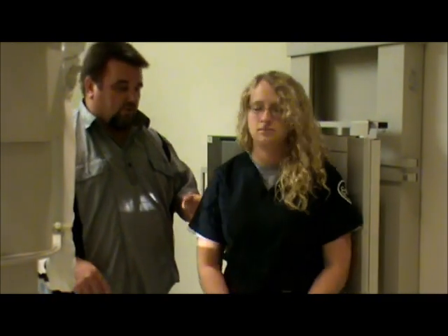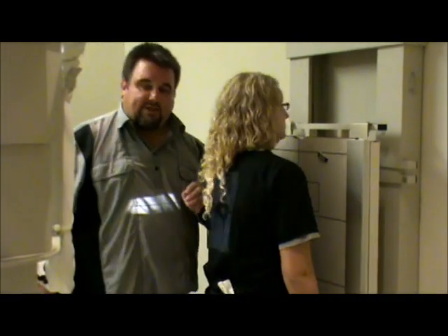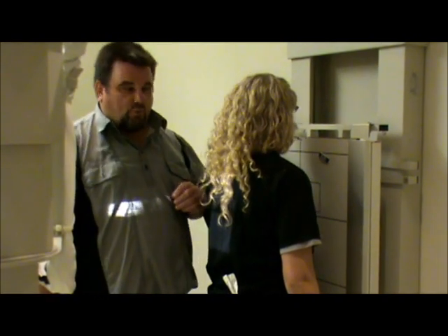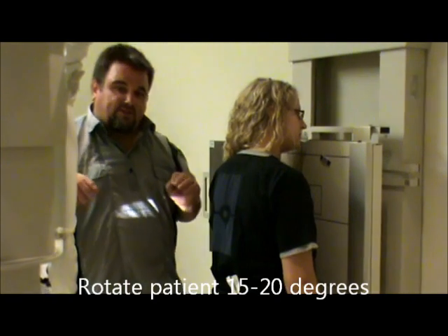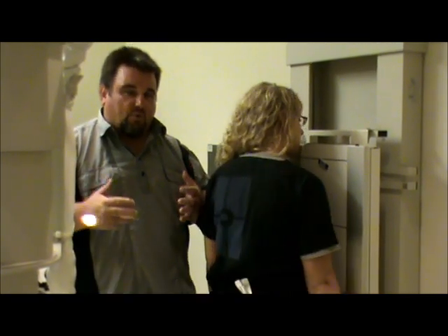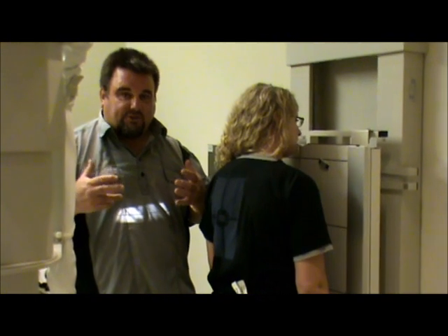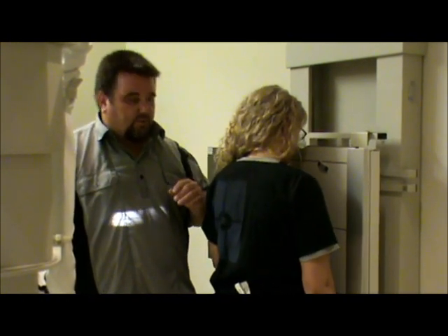We're going to have the patient turn around and rotate them. The rotation should be 15 to 20 degrees. It's going to be closer to 15 degrees for someone who is more big-chested. For a thinner patient, you would use a 20 degree oblique.